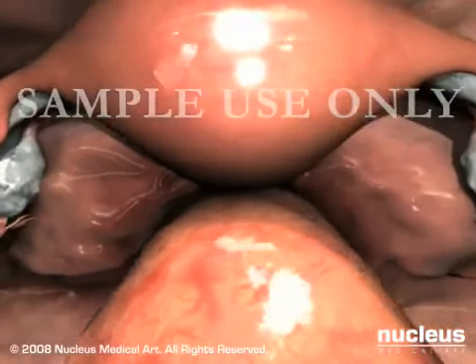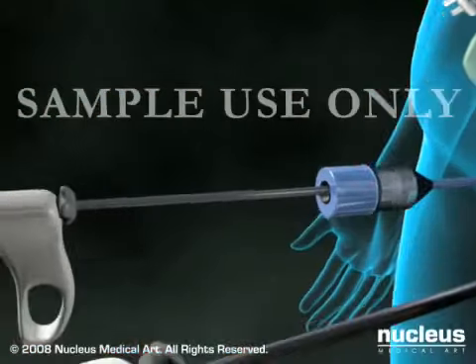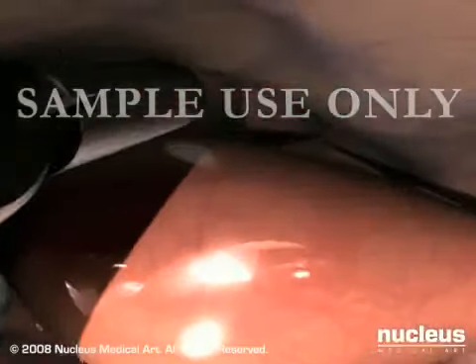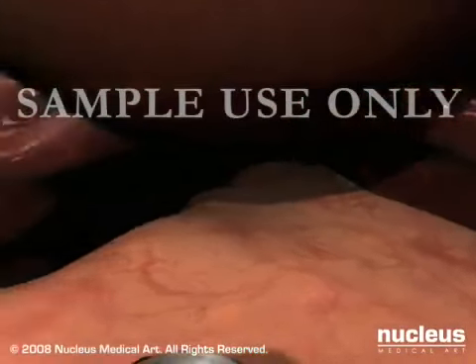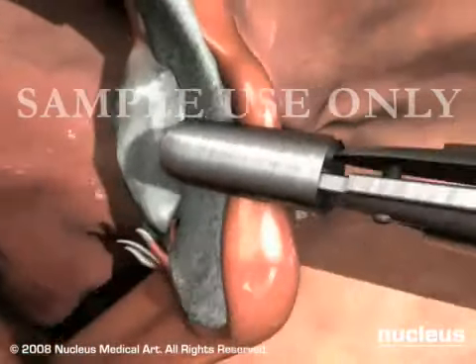Your surgeon will carefully examine your pelvic organs and tissues, looking for signs of disease that might explain your symptoms. He or she may create other ports through which instruments can be slipped. These additional instruments are used to move organs out of the way for better viewing, or to perform operative procedures such as removing scar tissue, taking biopsies, or draining abnormal fluid.